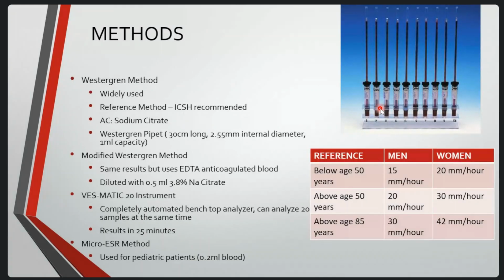So this is an example of our ESR. The most widely used method and the reference method as recommended by the ICSH is the Westergren method. The anticoagulant here is sodium citrate, the black cap. This is also what we call the Westergren pipette.